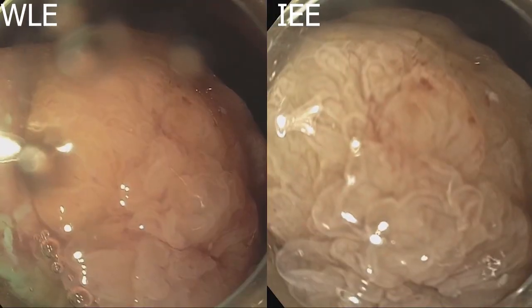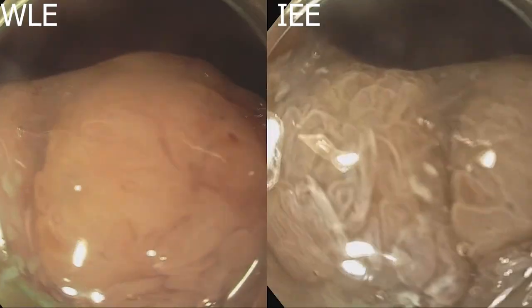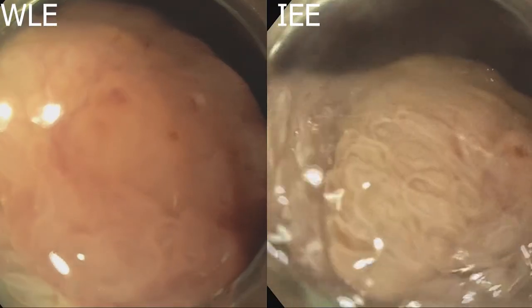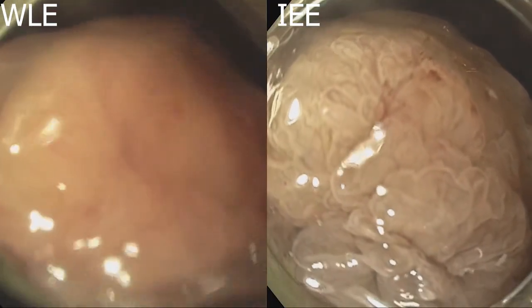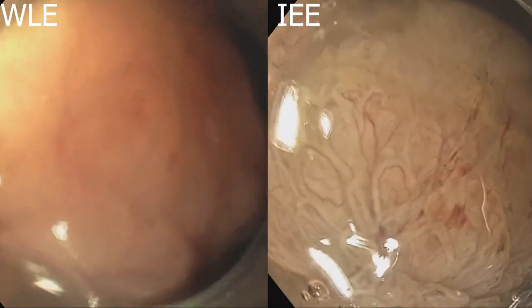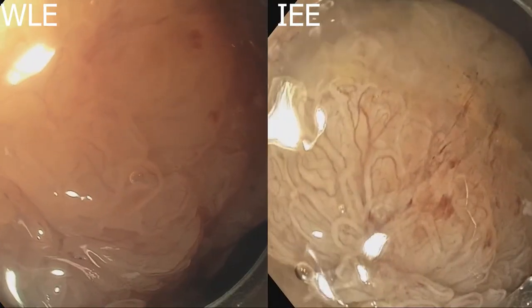Here we have another side-by-side comparison of a frond-like villous bulky lesion. With white light, lesion examination is somewhat limited by the overlying mucus film over the surface of the polyp. In contrast, the use of texture and color enhancement technology helps overcome these issues, allowing for more detailed visualization of the lesion's surface vascular pattern.